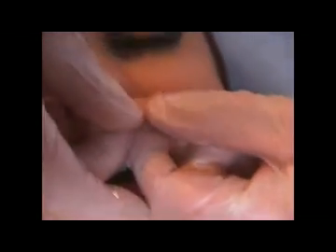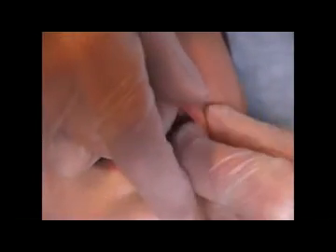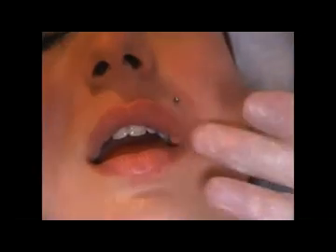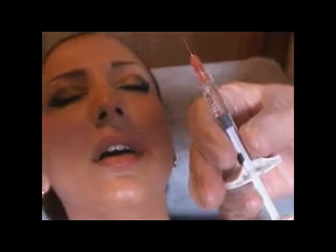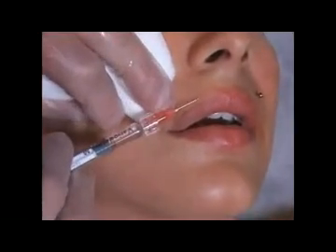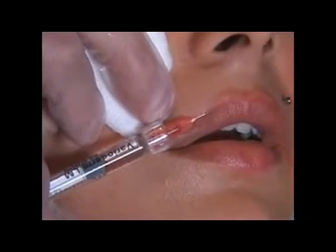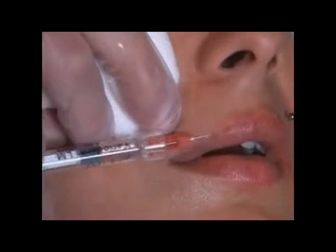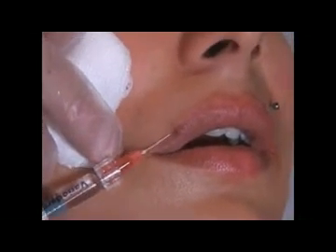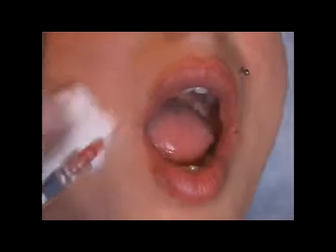In lips with hyaluronic acid I have never seen a granuloma — I've only seen nodules. And nodules, if there is a problem, you can dissolve with hyaluronidase. I just gave half a syringe — you see the incredible volume effect. The sharpness of the needle is normally upwards. You fix, go in, just a little bit for the border and a little bit more for the volume, then out. Fix, just a little bit for the border, a little bit for the volume, out.